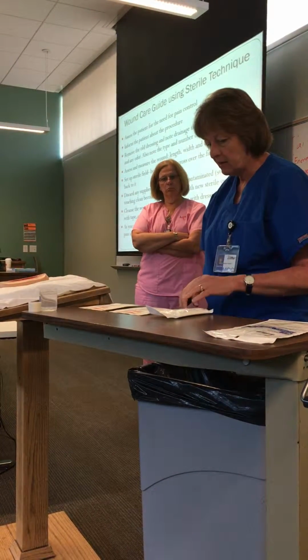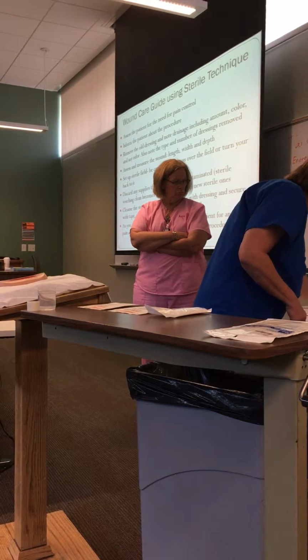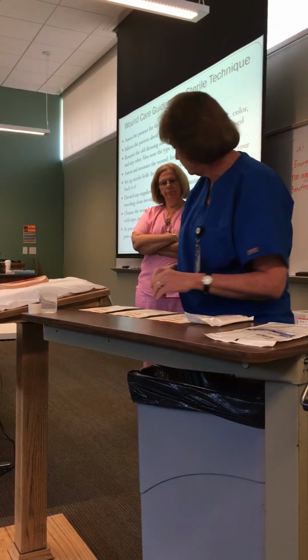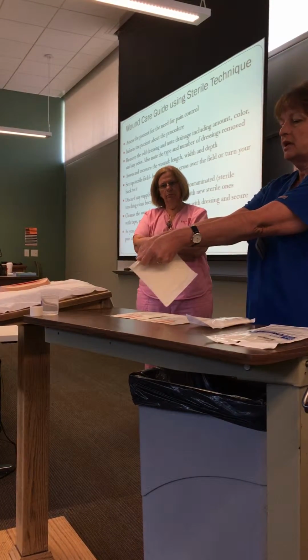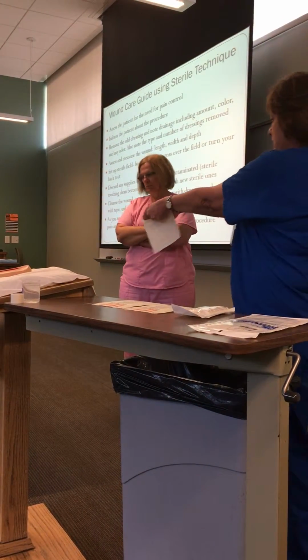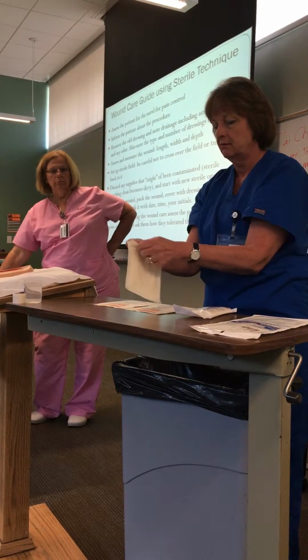So I need to open up my gauze sponges, and I believe you use 3. I don't remember for sure. So it is 3. Yeah, that's what I thought. How you want to open these up, guys, is you want to get your thumbs all the way across. Okay, all the way across. It gives you better leverage for opening these gauzes.